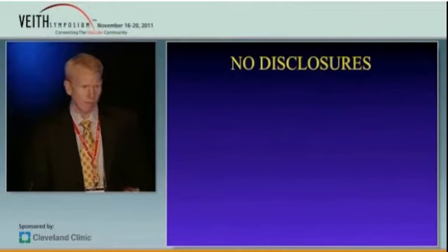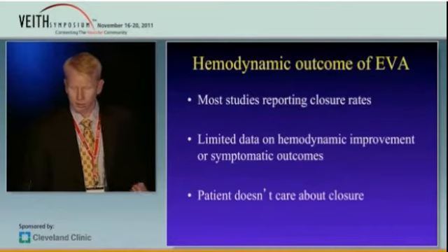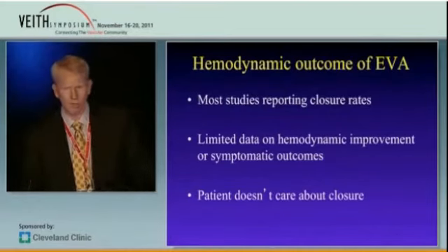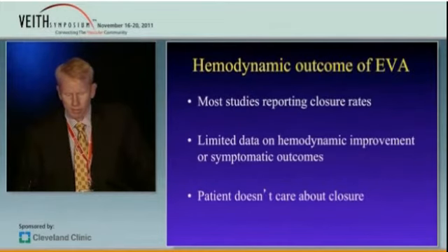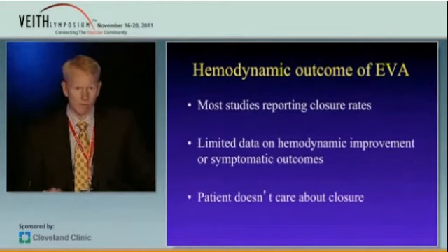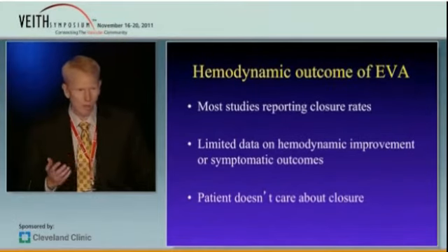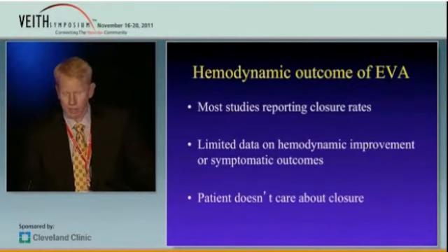We got interested in this because when endovenous ablation came out, everybody talked about closure, closure, closure. Well, you go and talk to your patient, they don't really care about that. They care if their leg feels better, and if their veins are gone and they can get back to their lives. And we had a long history of using plethysmography, and if you have a practice where a lot of the patients come to you after having previous venous procedures and they still have symptoms, or if their symptoms don't always match, a hemodynamic measure can be really useful in sorting things out.